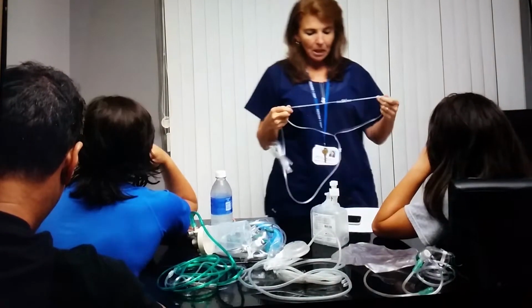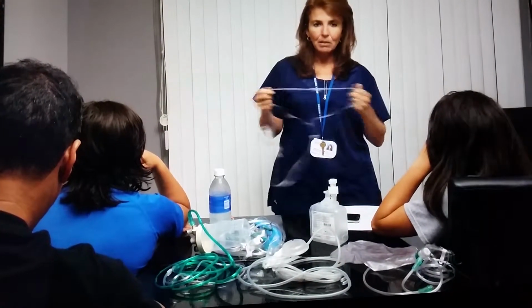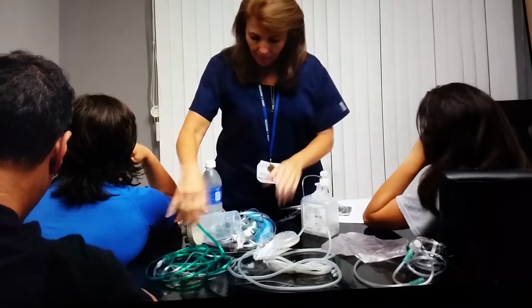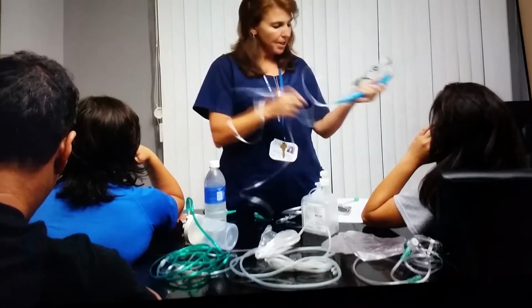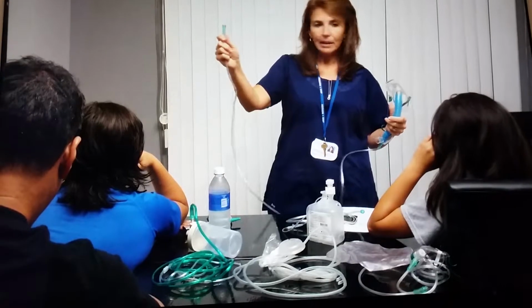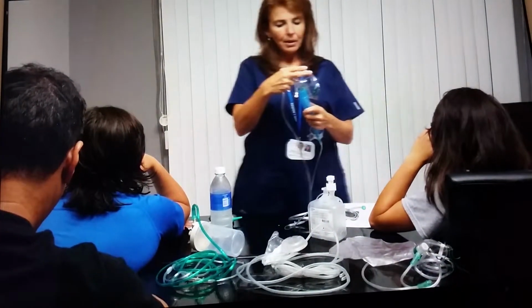Once the patient has needs greater than 6 liters, we may need to look at a different device, because on your basic nasal cannula you cannot go higher than 6. So at that point we may look at a Venturi mask. This type of device actually entrains room air, and it mixes with the amount of liter flow that we have bled in to give the desired FiO2.